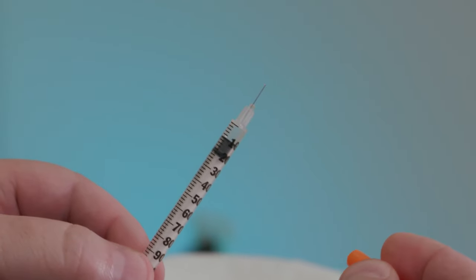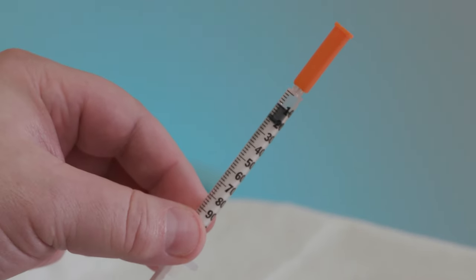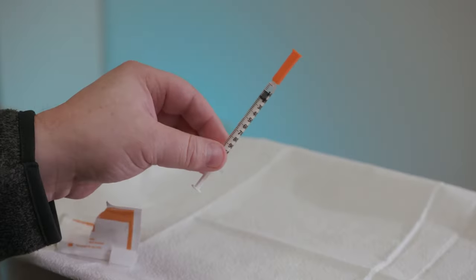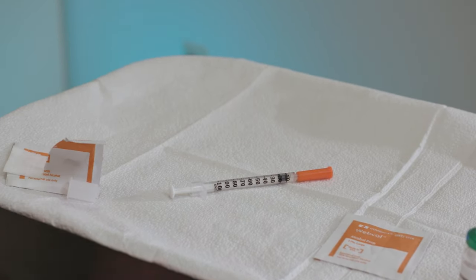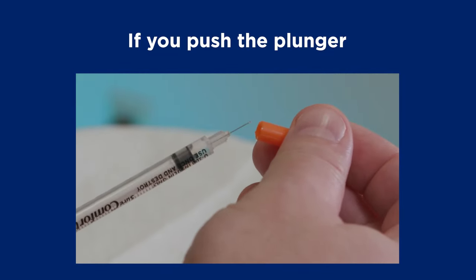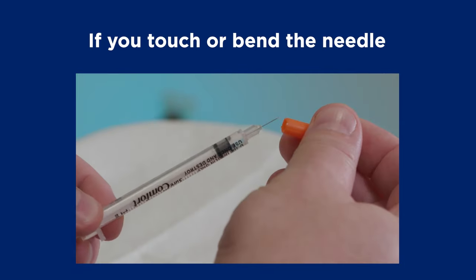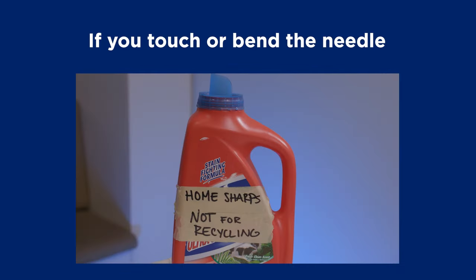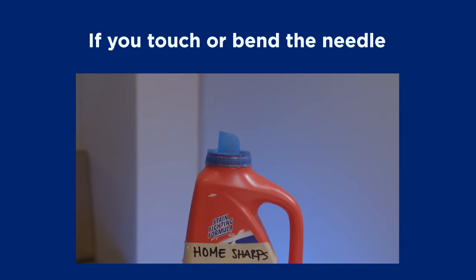Put the cap back on the syringe without pushing the plunger or touching or bending the needle. Set the capped syringe down. If you push the plunger, you may need to draw up more medication to make sure you're getting the right dose. If you touch or bend the needle, you'll need to put the syringe in your sharps container and start over with a new one.